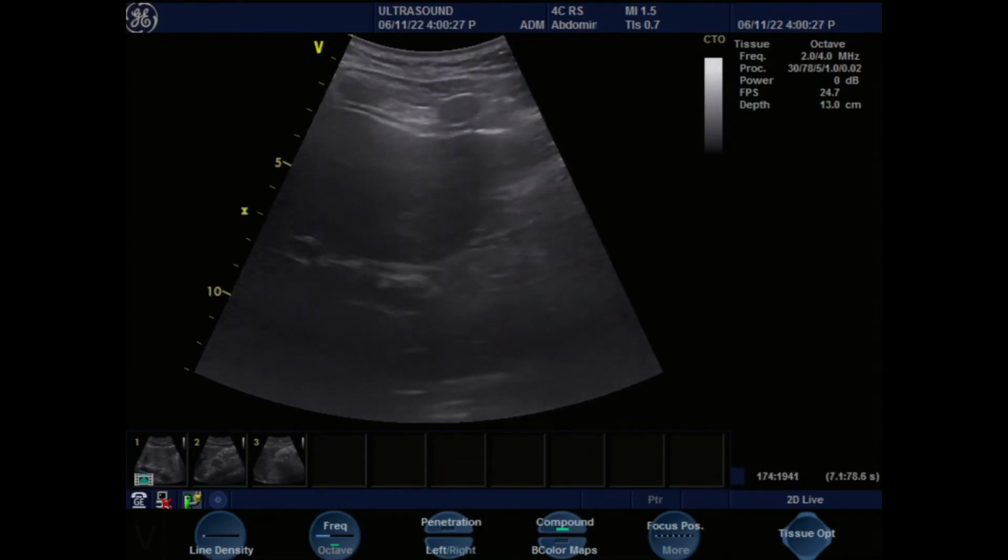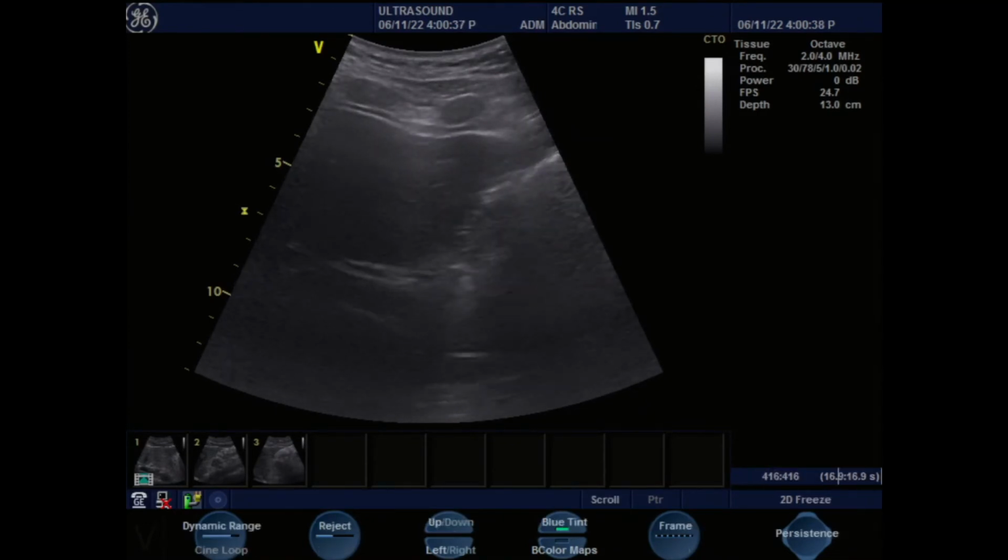So that's the body part right there. You see it? It's the plain one. The hepatic artery comes off the aorta, like the celiac, and it sort of crosses like this. So on that image, it's going to go across obliquely, left to right.